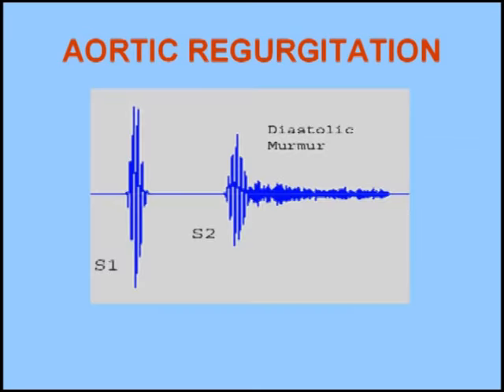The murmur of aortic regurgitation is heard best with the diaphragm pressed firmly against the chest wall.